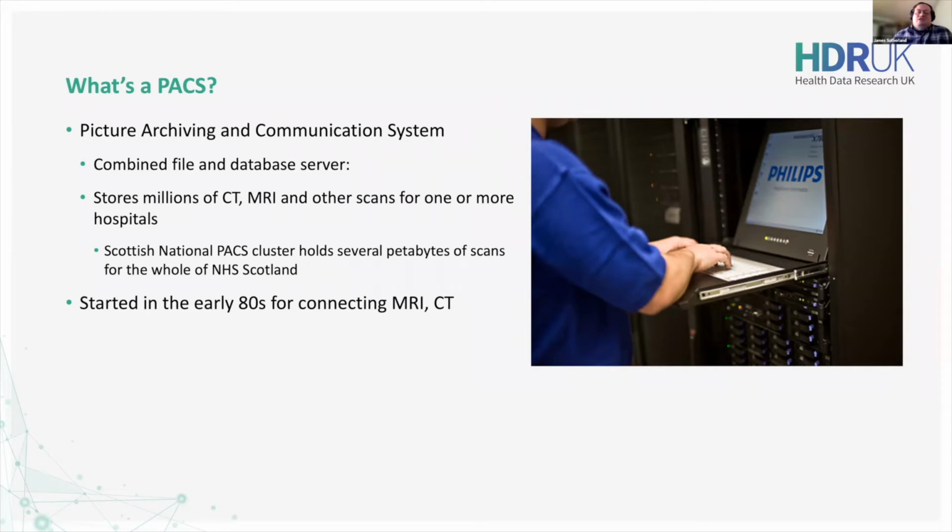So there is effectively a single archive of every MRI scan, every CT scan, X-ray, ultrasound, and almost everything else that's been done in any hospital or clinic in the whole of Scotland for the last 11 years now, all stored in one place in Edinburgh. There's a picture of one on the right, courtesy of Philips. That's actually a PACS system of theirs. They are, in fact, the company that runs the Scottish National PACS system at present via their acquisition of a company called Carestream, which wrote the underlying software.